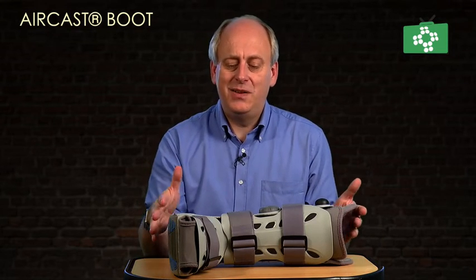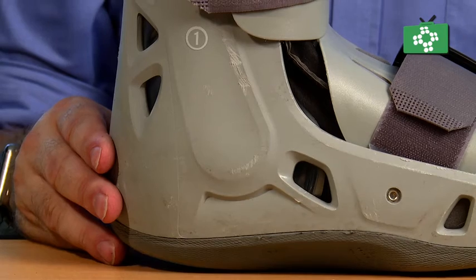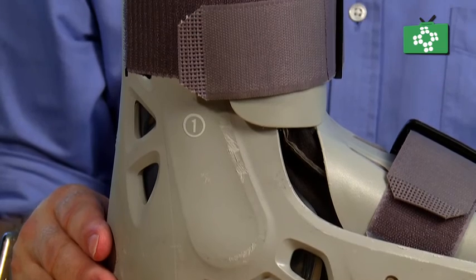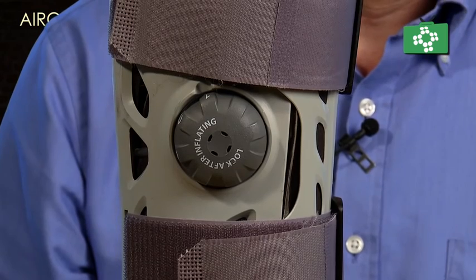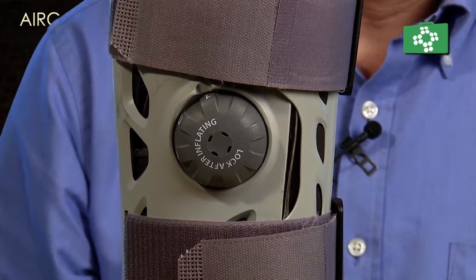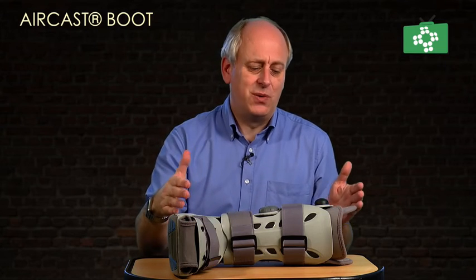To keep the inside clean, you can wipe the outside over and clean the inside as best you can with a cloth. One other thing to make it more comfortable — you can just use a normal sock. But it does come with a long sock, which is quite good because it keeps your foot warm, keeps it protected, and also stops the boot rubbing on your skin.